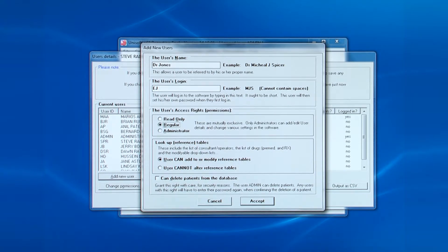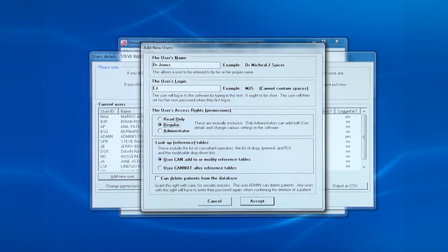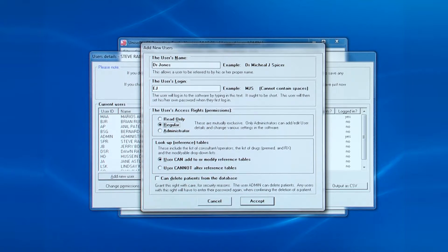The next box allows you to say whether the user can add to or modify the drop-down boxes or not. Note that the bottom checkbox, can delete patients from the database, is grayed out because admin did not log into this software. As already said, only admin can set or change this permission.